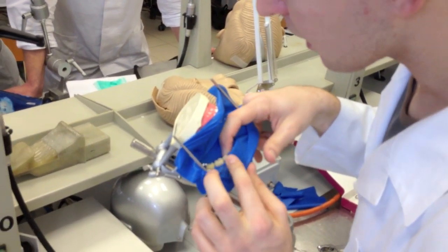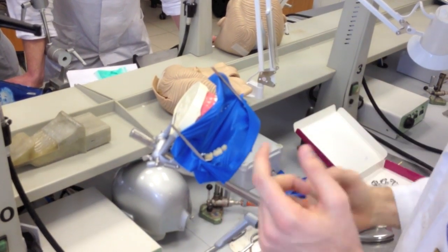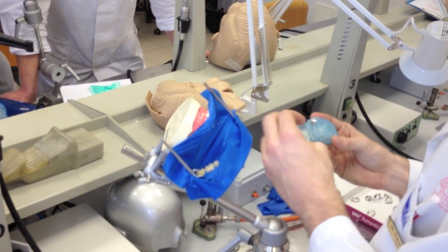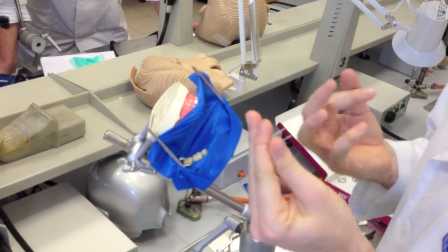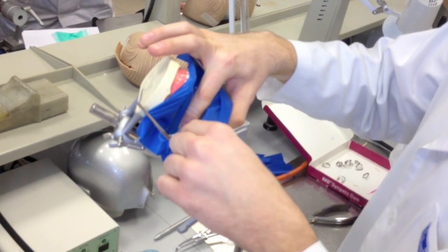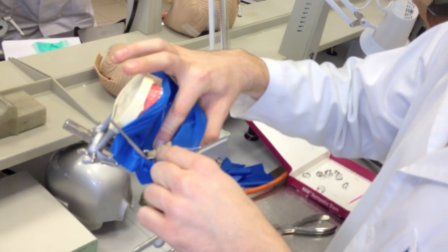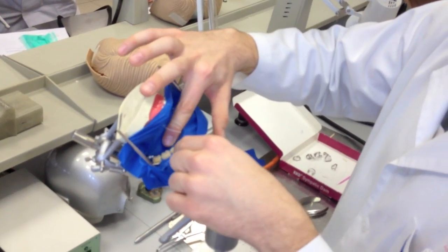This is how it looks. In this case we are lucky because we have quite large approximate spaces, so we don't have to use the floss. But in most cases we have to use dental floss, just to be sure that the rubber crosses the approximate contact junction. You have to push it down, because then you can have the best isolation.